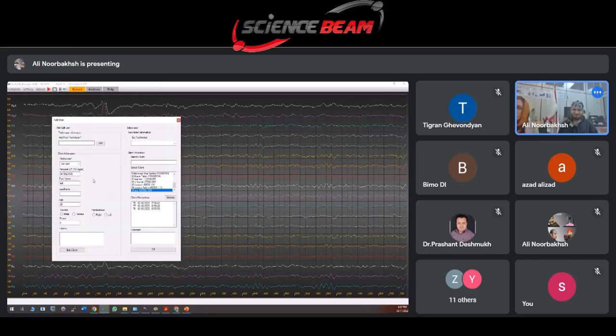Oh, cannot see. And I select the name of the client, and I write the event, QEEG. We should write it, QEEG.